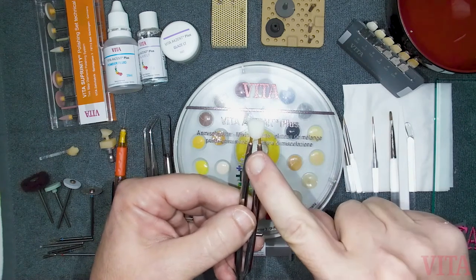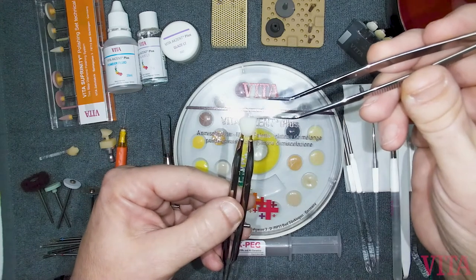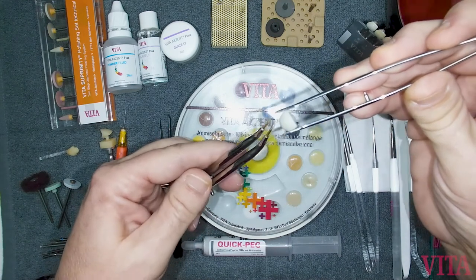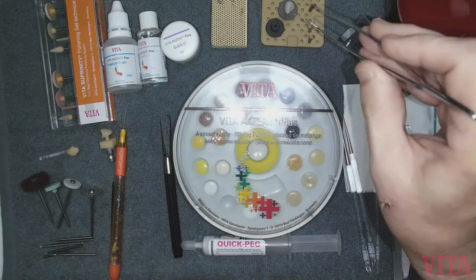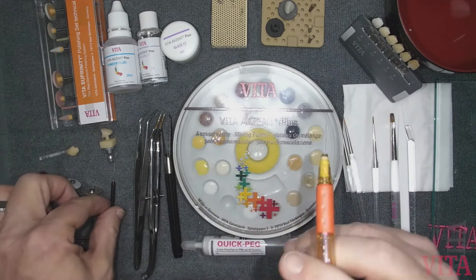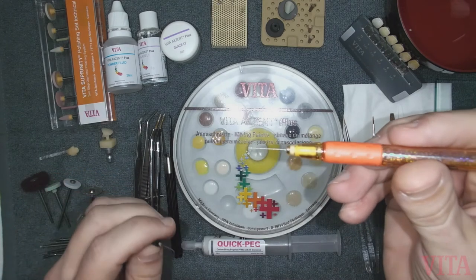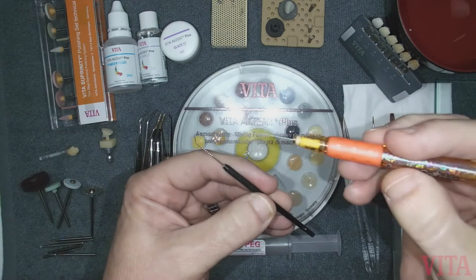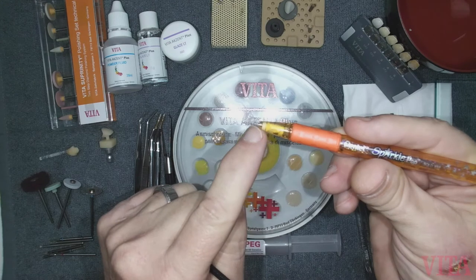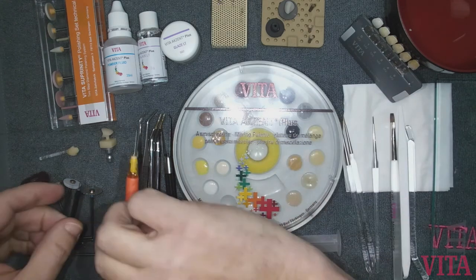If you're using a crown holder, you'll need a separate pair of tweezers so that after you've applied your stain and glaze, you can loosen it and transfer the crown to your firing tray. If you want to add craze lines or crack lines, or draw a color stain through the interproximal area or occlusal aspect, you can use an old endo file. You can create your own tool using an endo file: take a Bic cartridge, remove the ink cartridge, put an endo file in its place, and lute it inside — a nice handy endo file applicator.